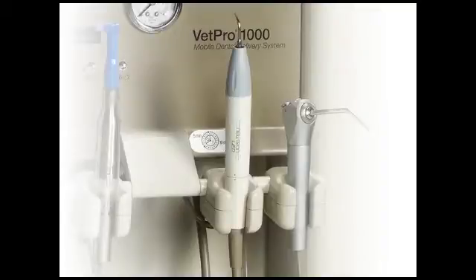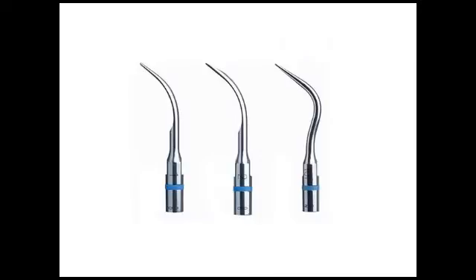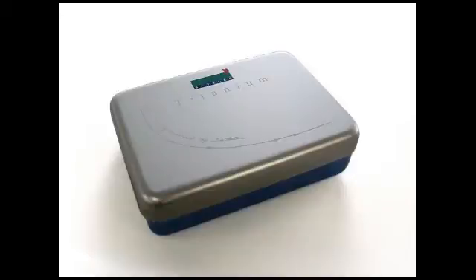If your VetPro 1000 unit is equipped with a scaler, you will also receive a Satellite scaler handle, a tip wrench, three different scaler tips, a tip wear guide, and a metal case for sterilization and storage of the tips.